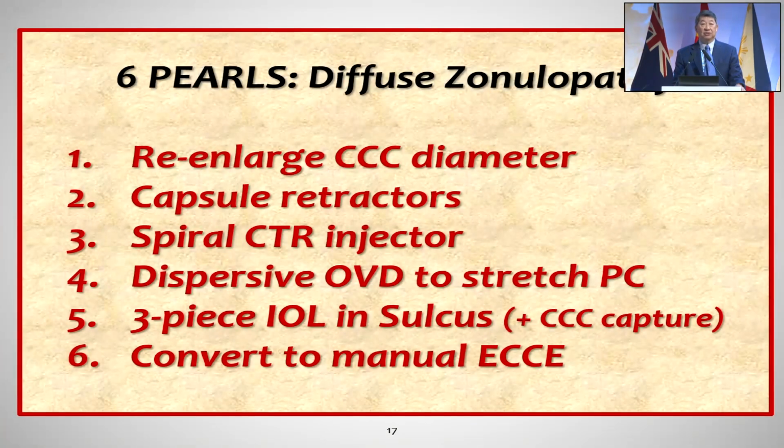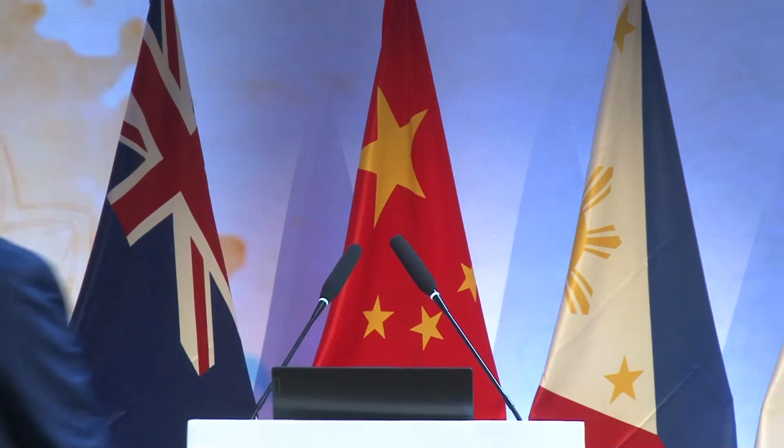So these are my 6 pearls. They're not things that we're all used to doing, and I hope this is helpful to you. Thank you very much.